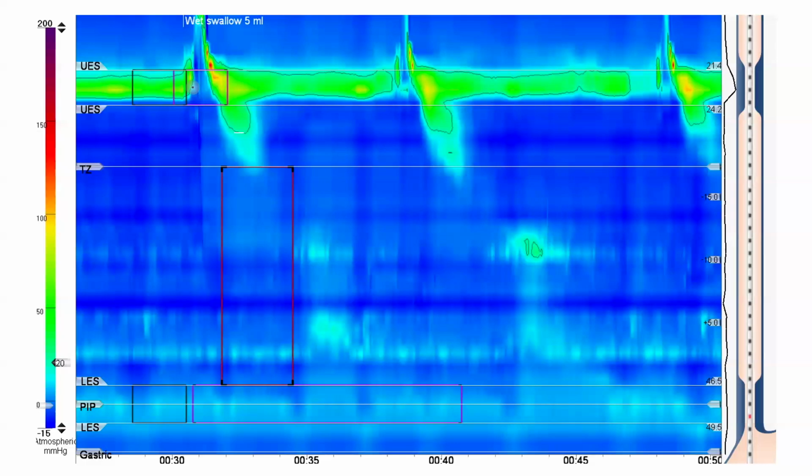Do you agree with what I'm saying? Really, I'm very, very happy to hear you explaining these points because unfortunately, for manometry, in most of the practice, they are just focusing on reading the report and then making the decision, either medication or surgery.